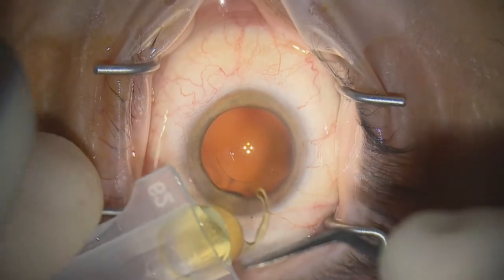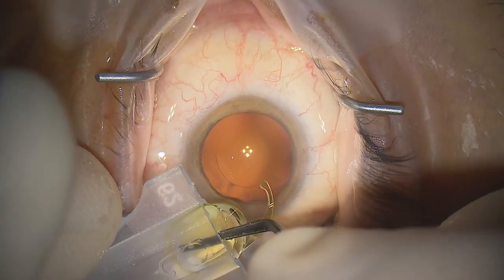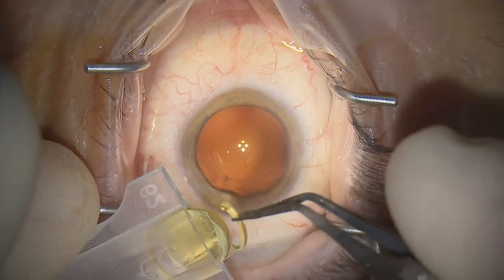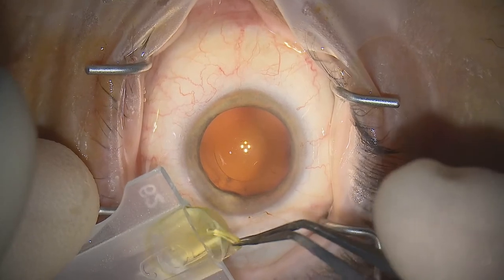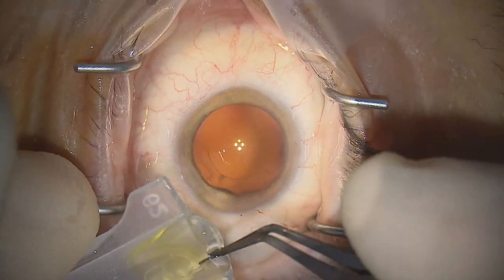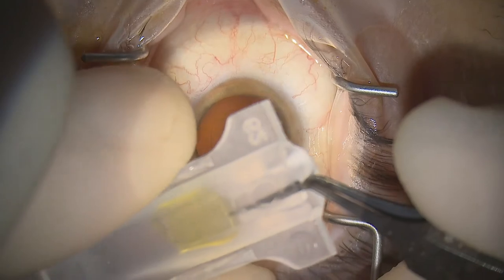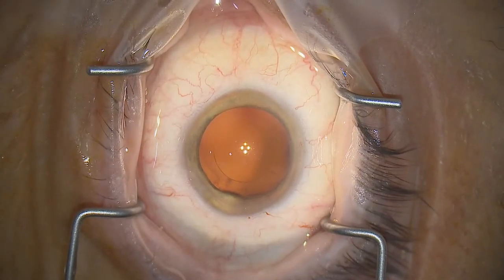We reach into the cartridge over the top of the lens optic with the Kilmer McPherson's, depressing the distal edge of the optic rather than touching the center to avoid instrument marks. Then we take the posterior haptic into the concave optic and pull the lens out to crimp the anterior haptic back into the concavity before advancing it as far as possible up the cartridge for engagement with the plunger.